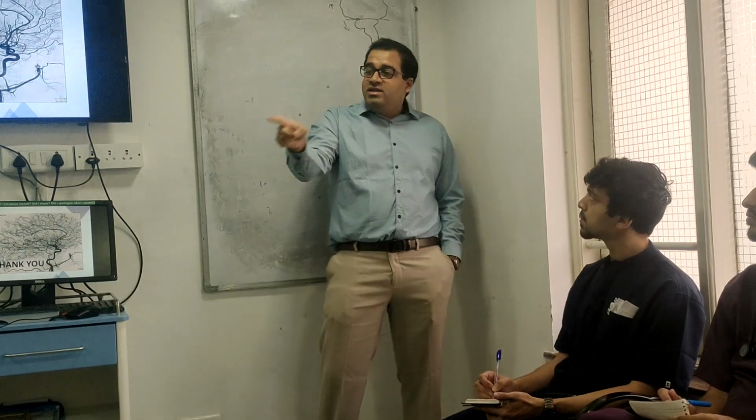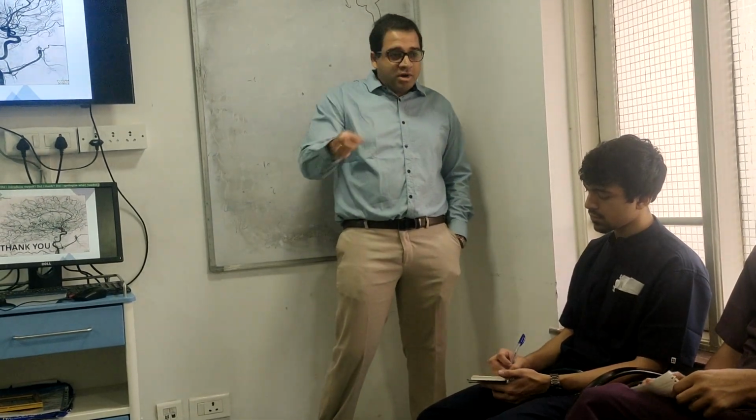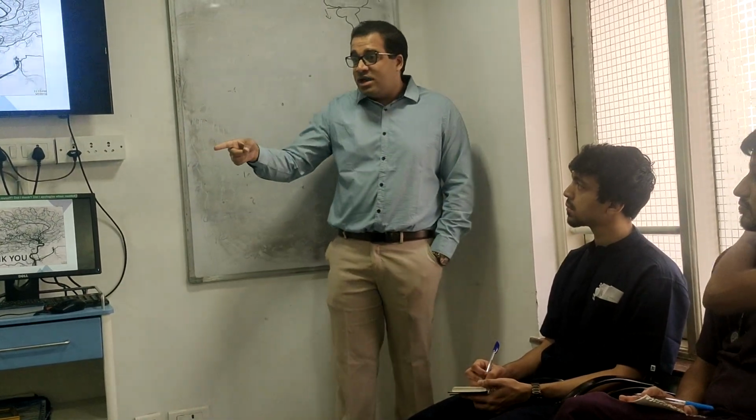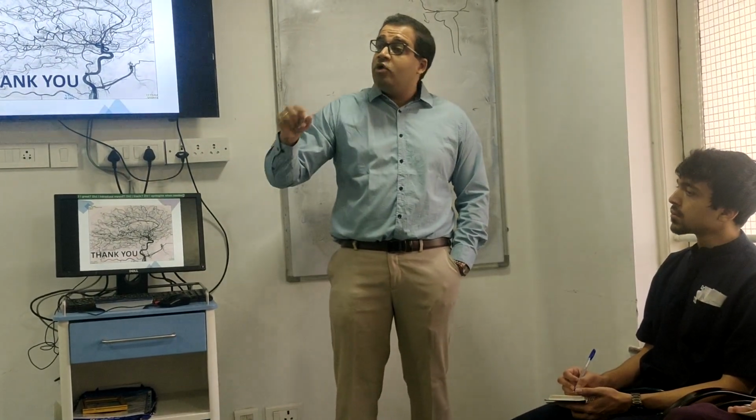And the reason why you have only these bottles here is because most of the patients coming to tertiary care will already be pre-treated with antibiotics elsewhere, which is why it makes sense to keep this set rather than the normal set. Normal set is a normal Bactec, which is a blue top and a yellow top.